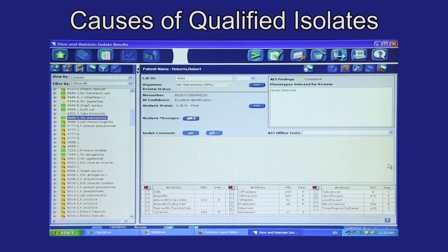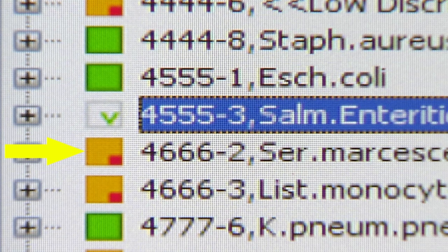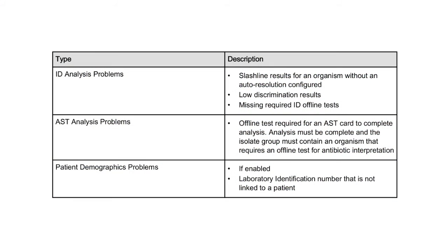Isolate results display in the View and Maintain Isolate Results view of the Vitec-2 system software. An icon beside each isolate represents its status. The qualified icon is an orange square with a red square in the bottom right corner. Qualified isolates may be preliminary, meaning test cards are still processing in the instrument, or final, meaning testing has completed. As the software analyzes the test card readings, isolates with certain characteristics will be flagged with qualified status.